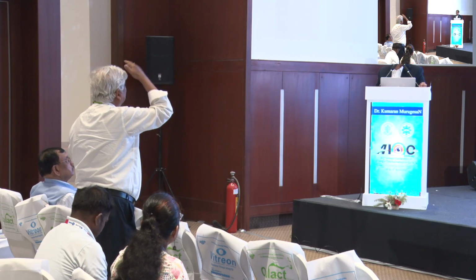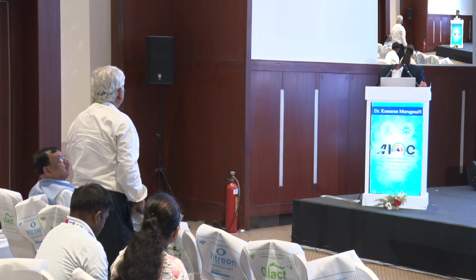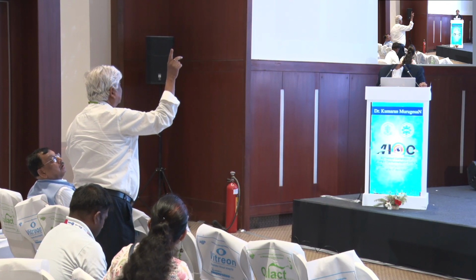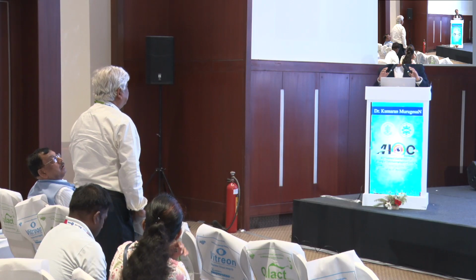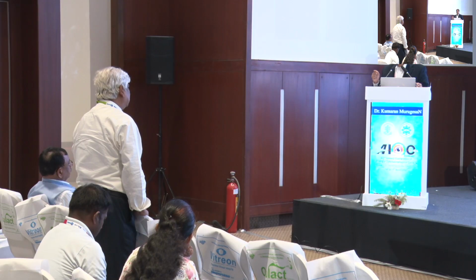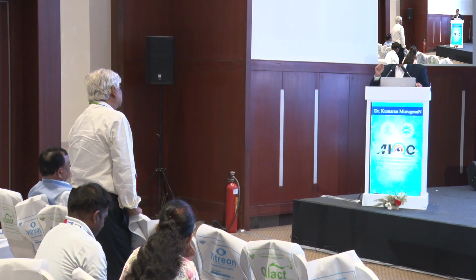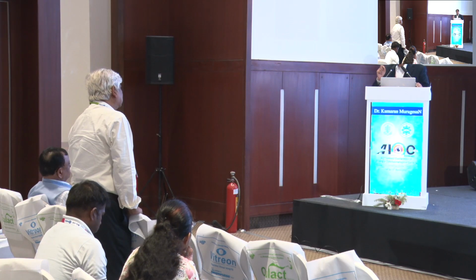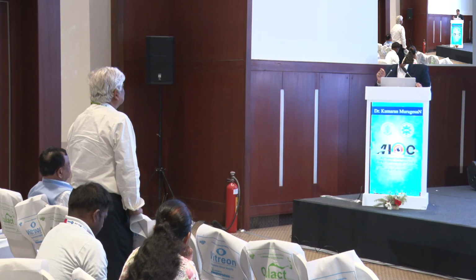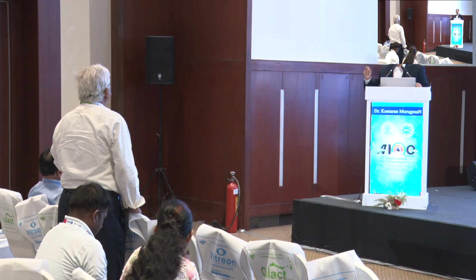What about the ultraviolet lamp? See, the ultraviolet lamp can be switched on in between your surgical theatre days just to prevent humidity accumulation. The ultraviolet sterilizer is not good. Why? Because the dose of sterilization needed varies for different organisms. It is not the same for every organism.